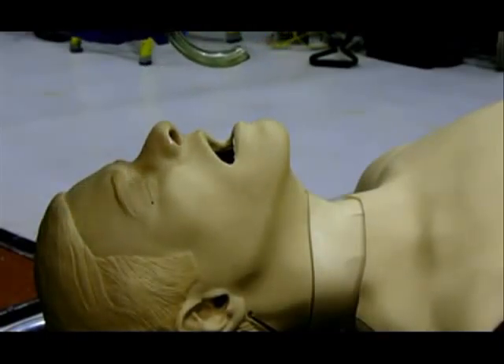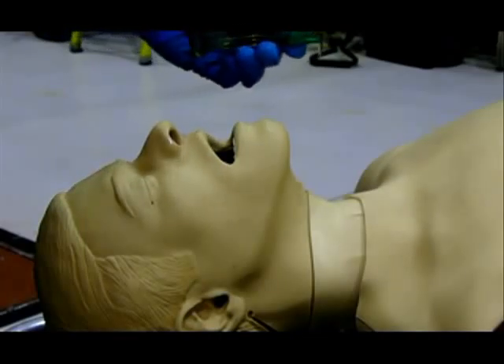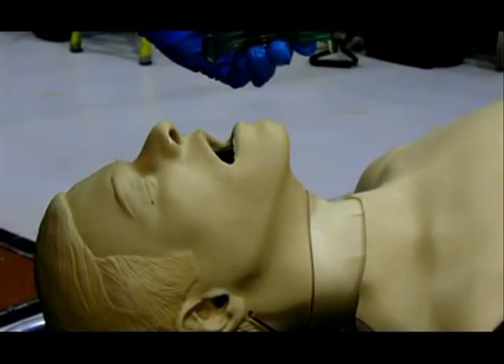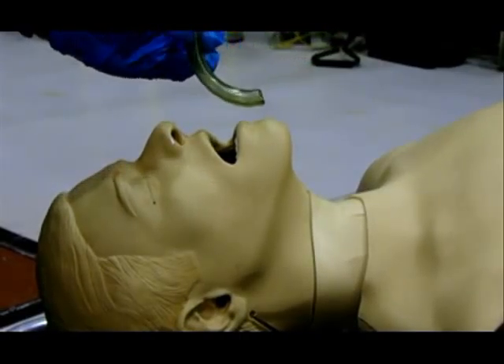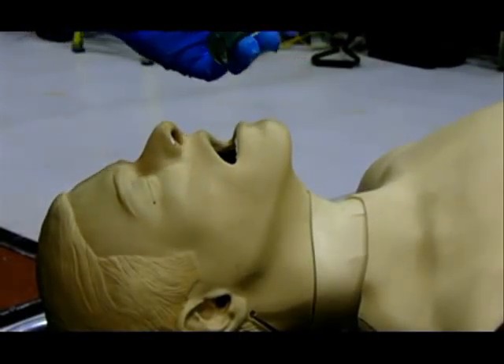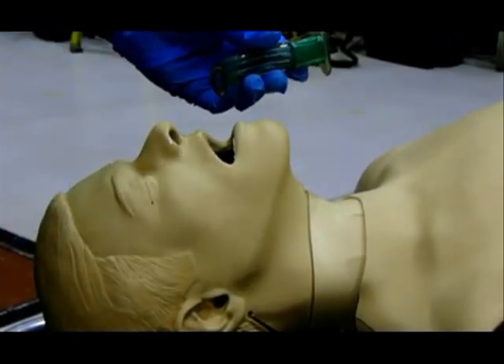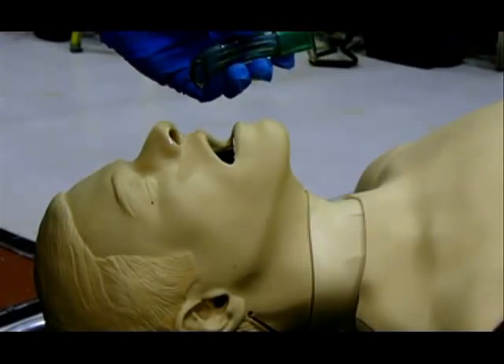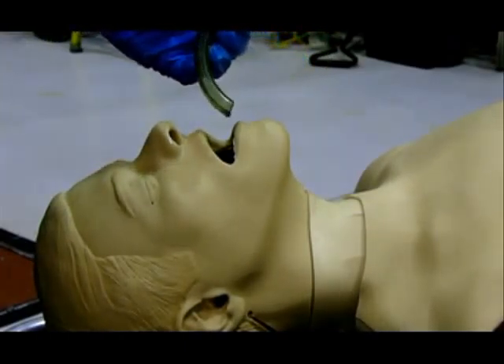An oral pharyngeal airway, or OPA, is placed in order to restore patency of a patient's airway that has become obstructed by the tongue, or an unresponsive or apneic patient that requires manual ventilation. Oral airways are made of hard plastic and have a semi-circular design that conforms to the curvature of the tongue and palate. When properly inserted, the OPA will hold the tongue away from the posterior pharynx and allow air to pass through and around the device.